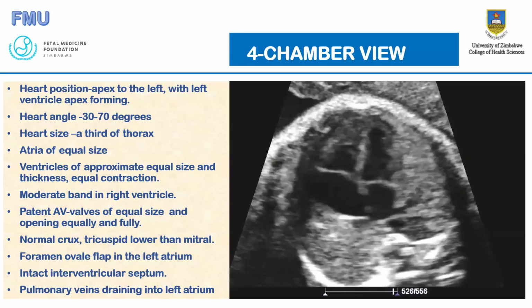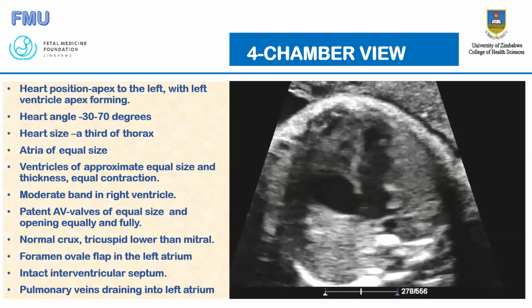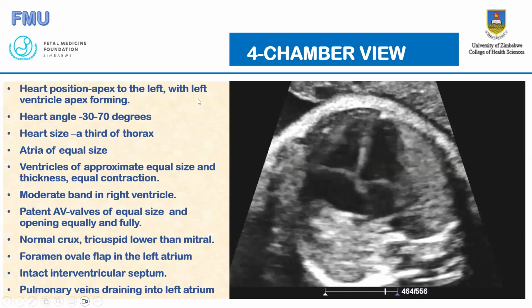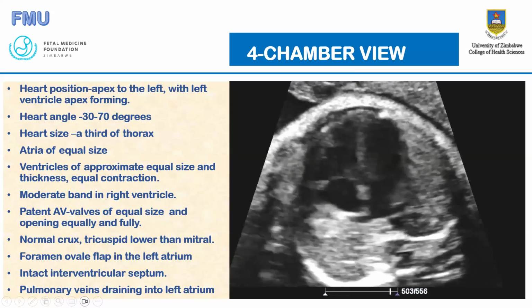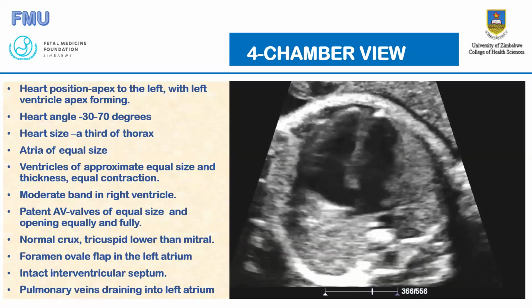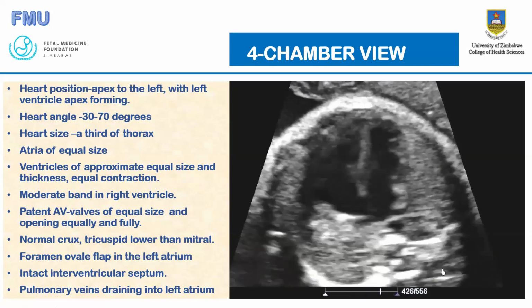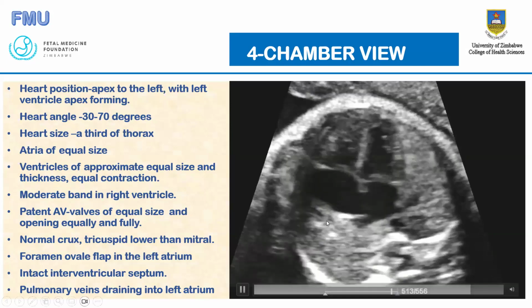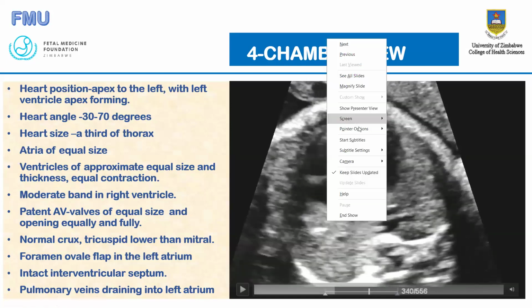Then how should you be systematic with your examination? First of all, look at the heart position. Is the apex pointing to the left? And when you are saying pointing to the left, there is an imaginary line that we should always acknowledge.